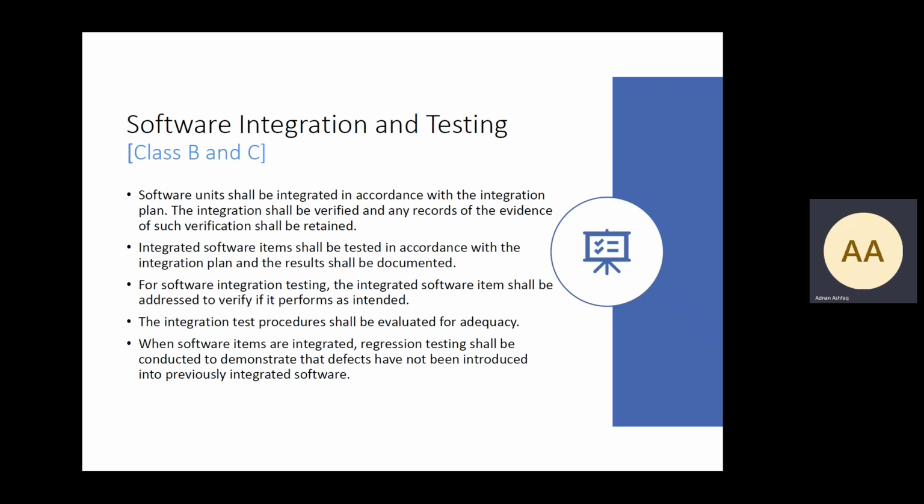For software integration testing, the integrated software item shall be assessed to verify it performs as intended. And then integration test procedures shall be evaluated for adequacy. When software items are integrated, regression testing shall be conducted to demonstrate that defects have not been introduced into previously integrated software.